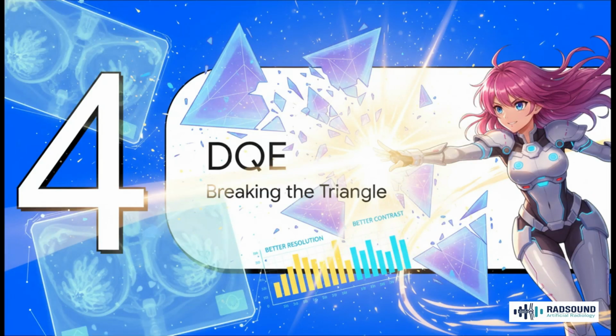So, we're trapped, right? It sounds hopeless. Better resolution costs dose. Better contrast costs dose. Lower noise costs a ton of dose. So, is there any way out of this trap? Well, yes. There is one hero in this story. There is one way to break the triangle.